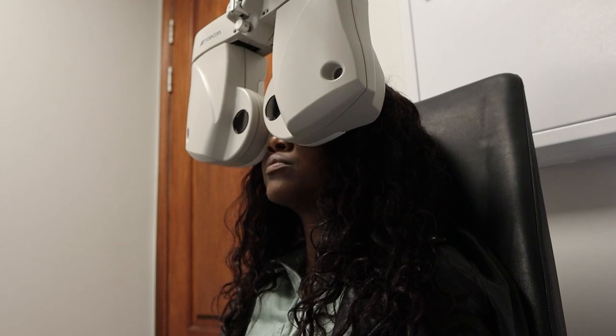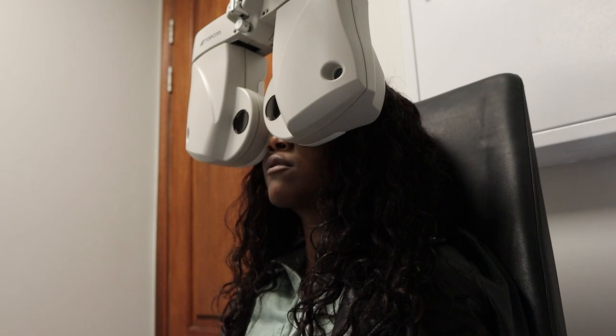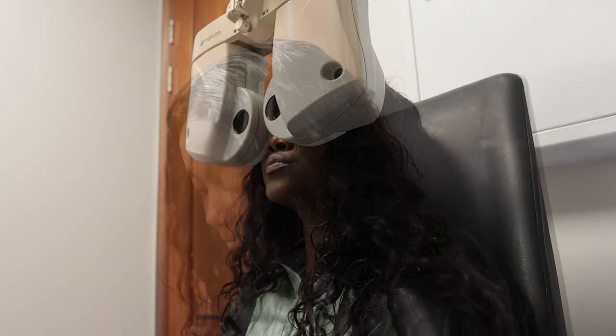Okay. So, read there for me. L-N-F-T-P. And over there? E-H-V-G-O. Over there? C-Z-S-A-B-A. Over there? T-Z-A-H-P. Over there. E-O-B-V-O. Over there. O-O-S-F-K. Those letters, are they clearer lens 1 or 2? 2.